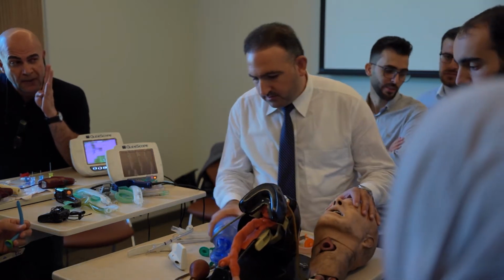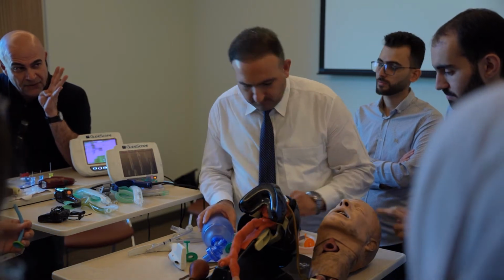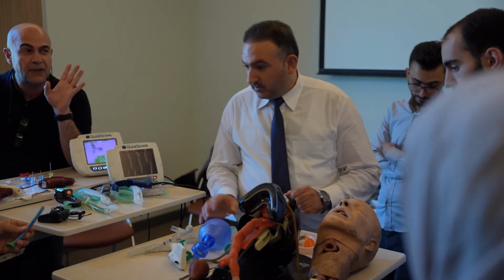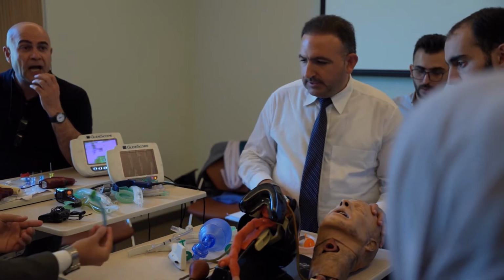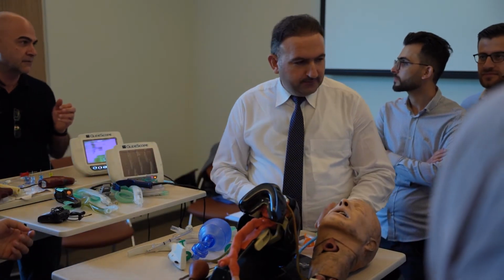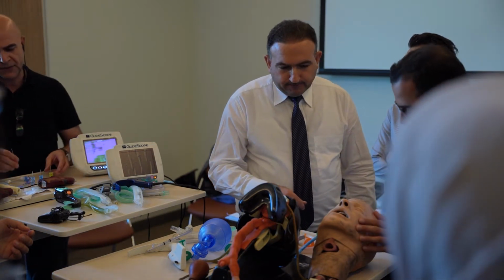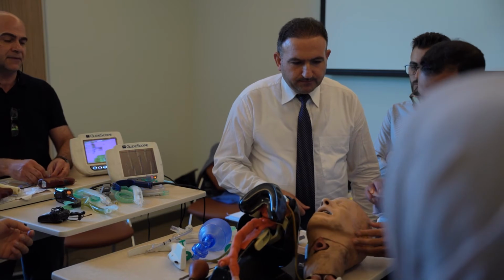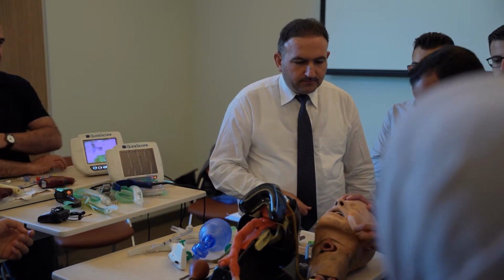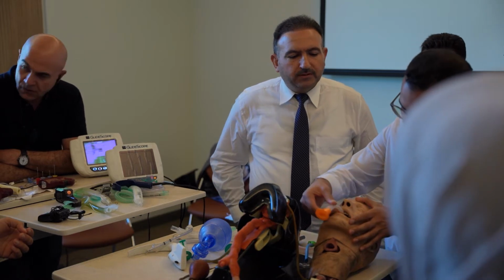So if you open the mouth, clean the mouth, and maintain the mouth with these basic adjuncts, that is all you need, believe me. And always there should be a valid working suction machine beside you. And don't worry, if there is any vomiting, you can turn the patient to the left.